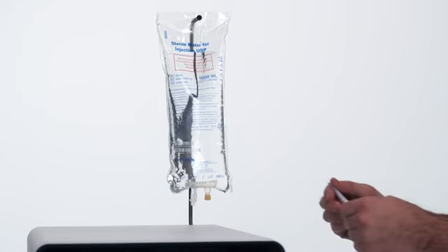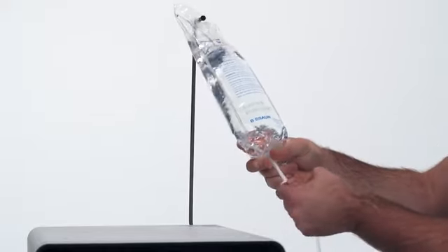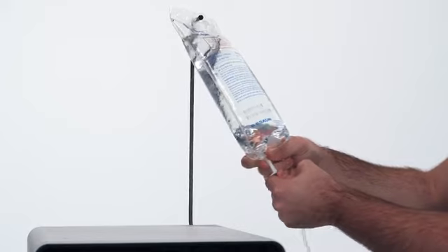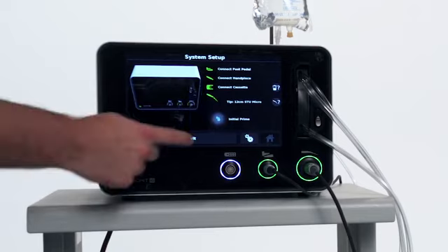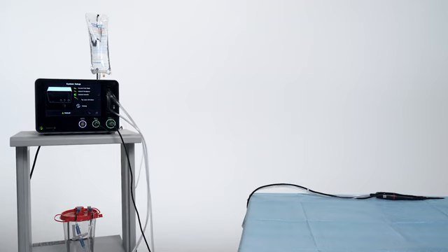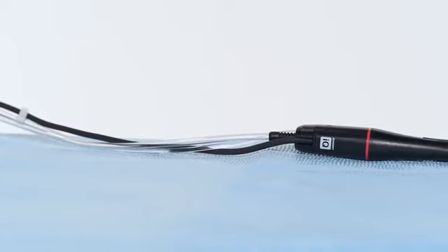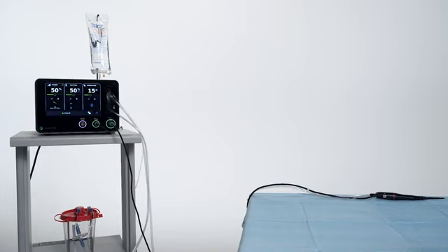Remove the protective cover from the irrigation spike. Insert the irrigation spike into the port of the irrigation bag. From the system setup screen, touch the initial prime button. Irrigation prime will automatically stop once fluid reaches the tip. The Sonopet IQ system will automatically default to the recommended settings as stated in the IFU per tip. Your Sonopet IQ system is now ready to be used.